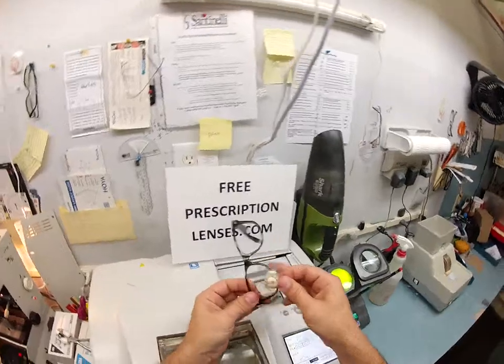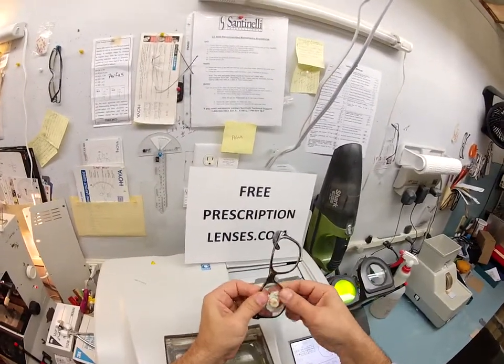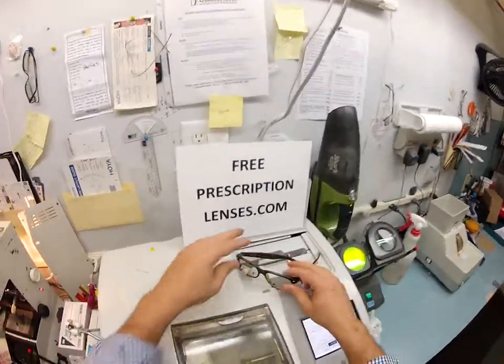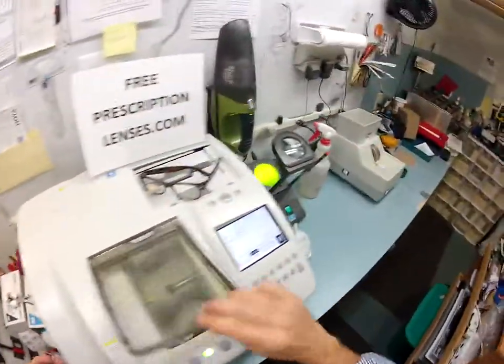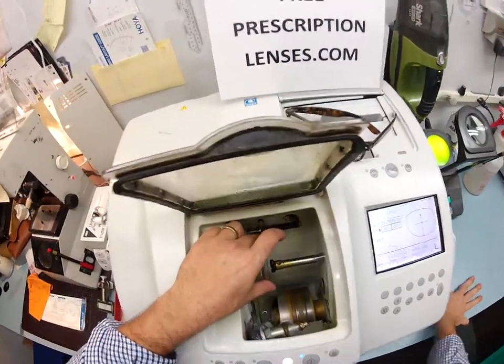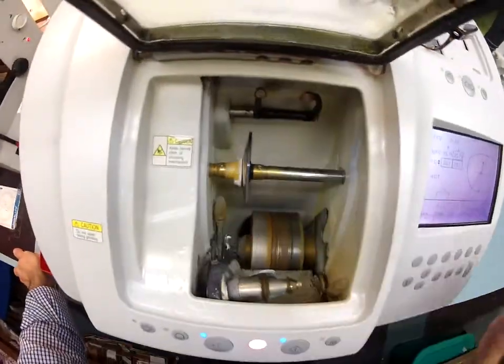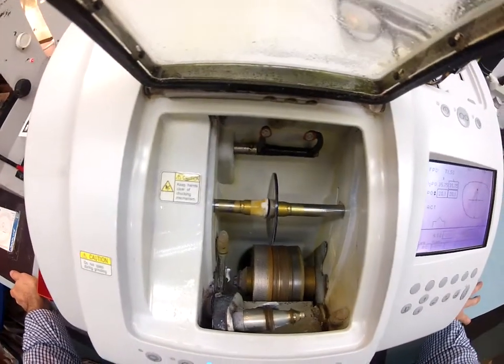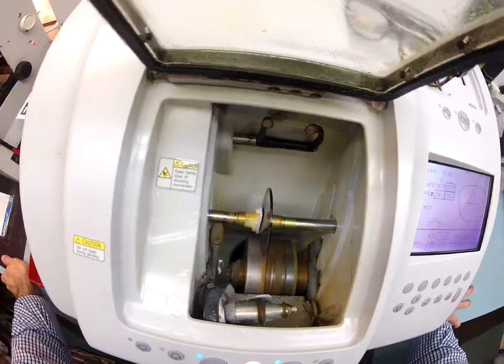Okay, I'm going to tuck it in at the outside corner first, and then using my thumbs, I'm going to press down at the nose. It snaps in perfectly that time. So let's go ahead and cut the left lens. Let's flip that over to the left and hit start. Just like before, this is going to come down and trace the shape of your frame onto the left lens to make sure it's large enough to cut out.